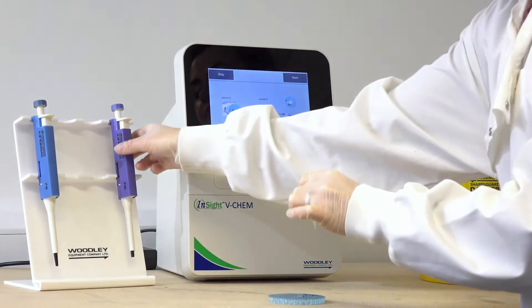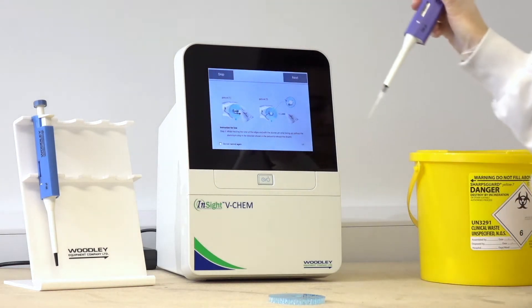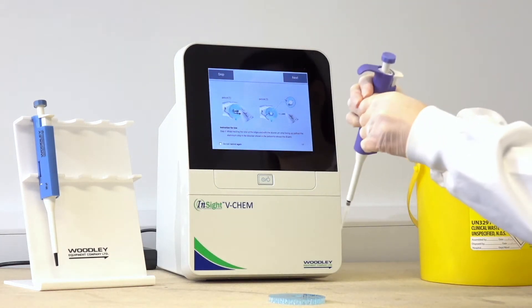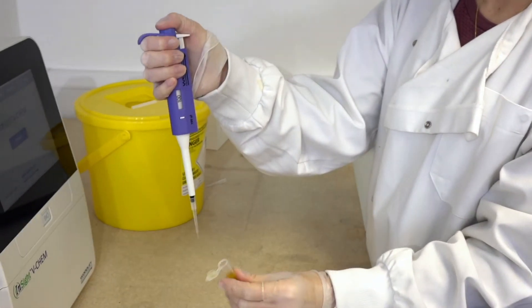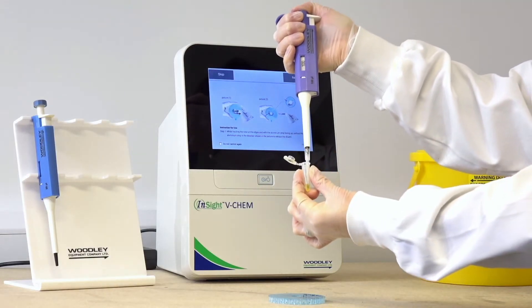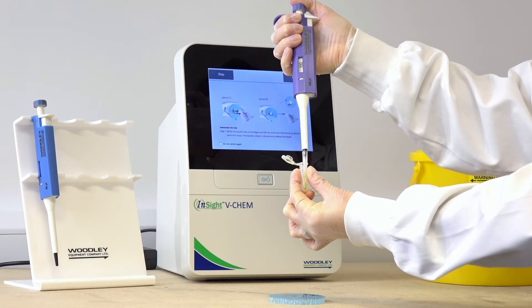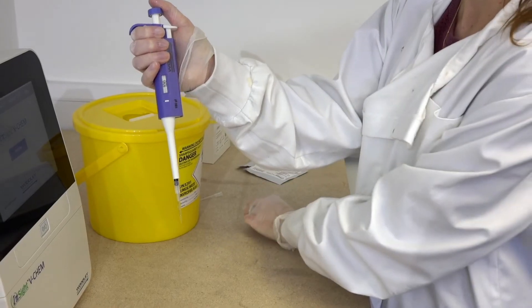Attach a new pipette tip to the end of the 100 microlitre pipette. Do not touch the end of the pipette tip. Using your thumb, push down the plunger on top of the pipette to the stop position. Insert the pipette tip into the serum, plasma or whole blood sample. Slowly release the plunger to draw up the sample. Avoid drawing in any air as this will cause the rotor to fail. Once the pipette tip is filled, remove the pipette from the sample tube.